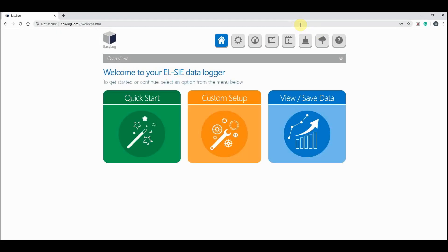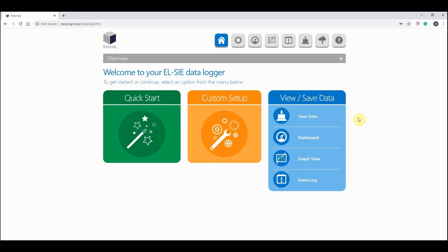If you then click on the view and save data icon, you will see these four options. Note that these options are also available at the top of the screen here.